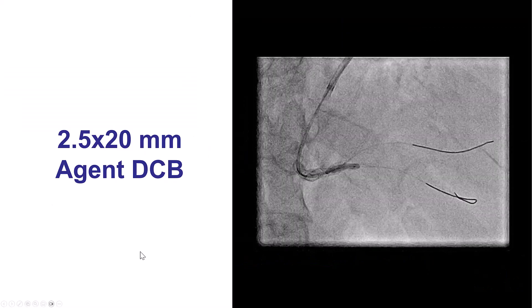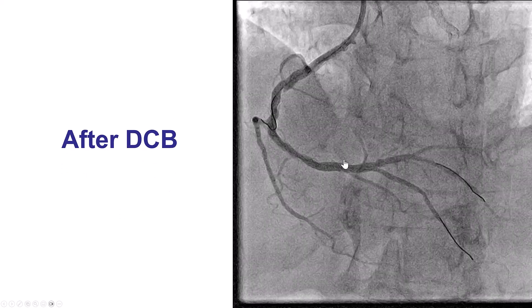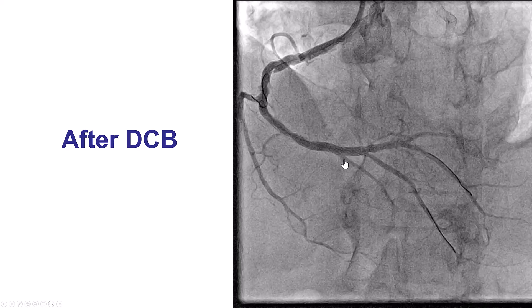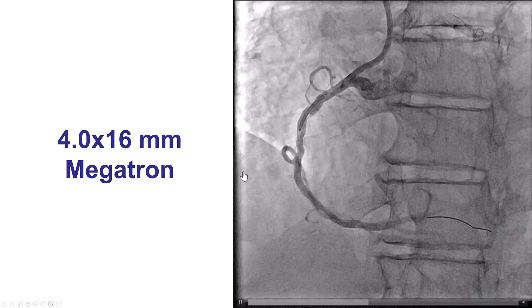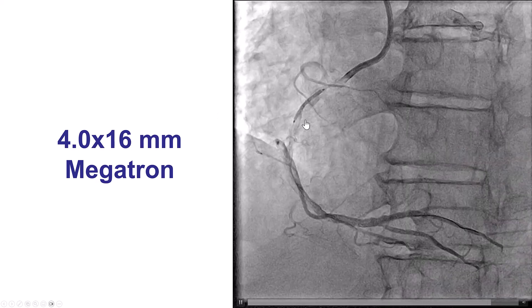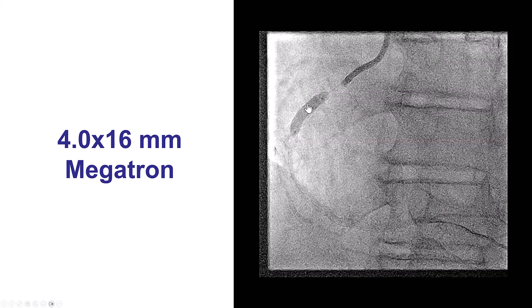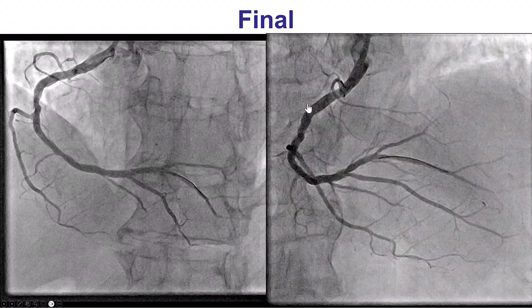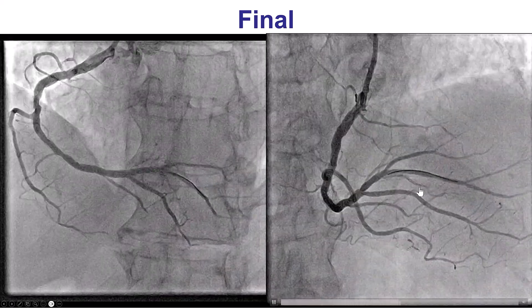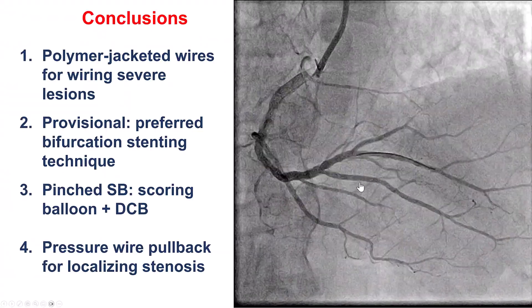We used a drug-coated balloon into the PDA to minimize the risk of restenosis, which made it look fairly good. We then placed a 4.0 by 16 mm Megatron stent across the proximal to mid-RCA lesion. This provided a nice result with TIMI 3 flow into the right coronary artery, excellent flow into the PDA, and the patient had an uneventful recovery.